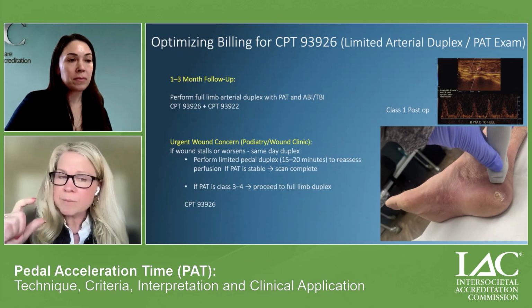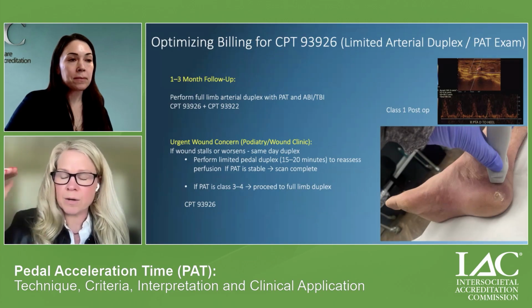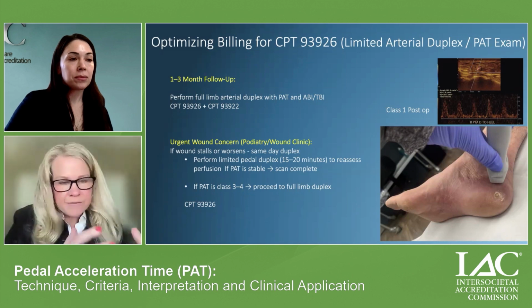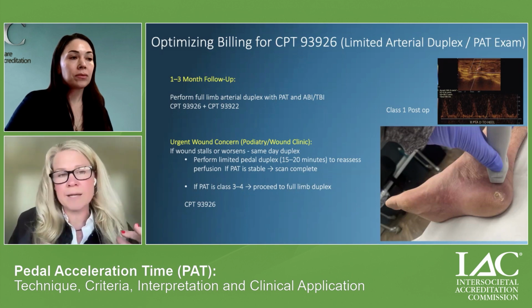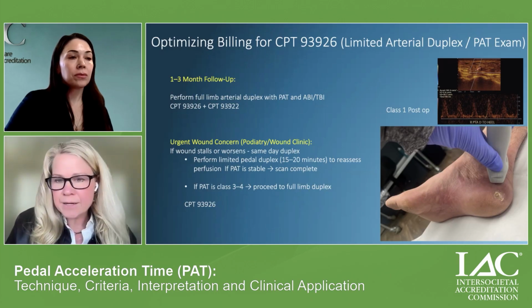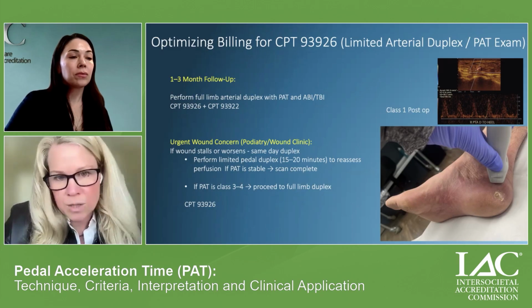But one of the other really beautiful things about the pedal duplex scan is when we are working with our wound care and podiatry colleagues. So let's just say that we did the revascularization, we did the 1 to 2 week post-op, it was class 1, and 2 weeks later, the podiatrist calls or the wound care doctor calls and says, hey, the wound is stalling and it's getting worse.